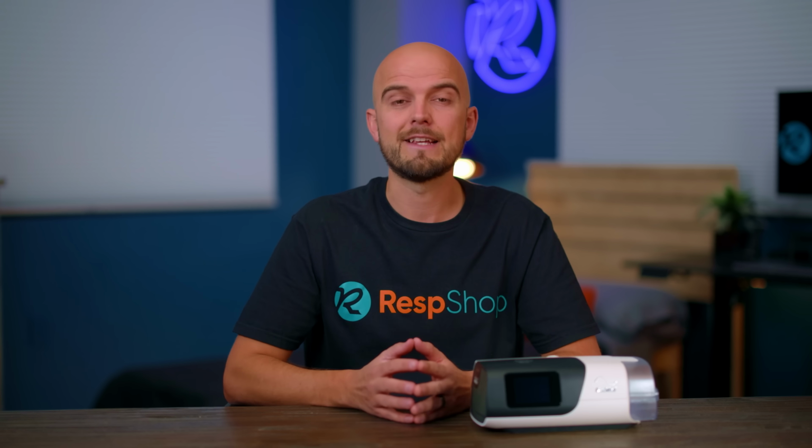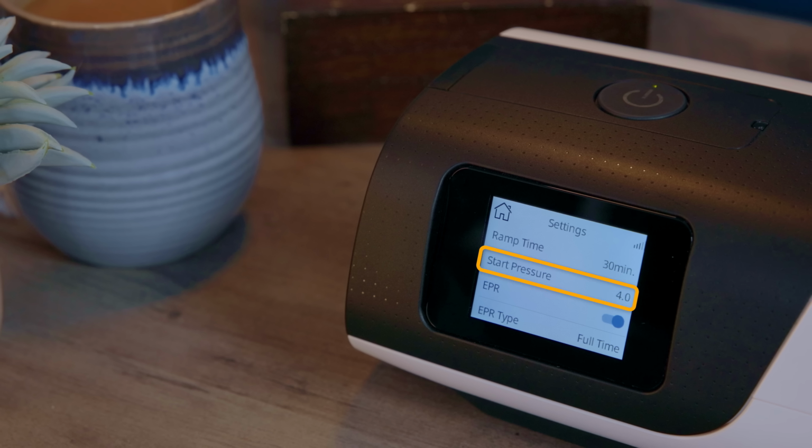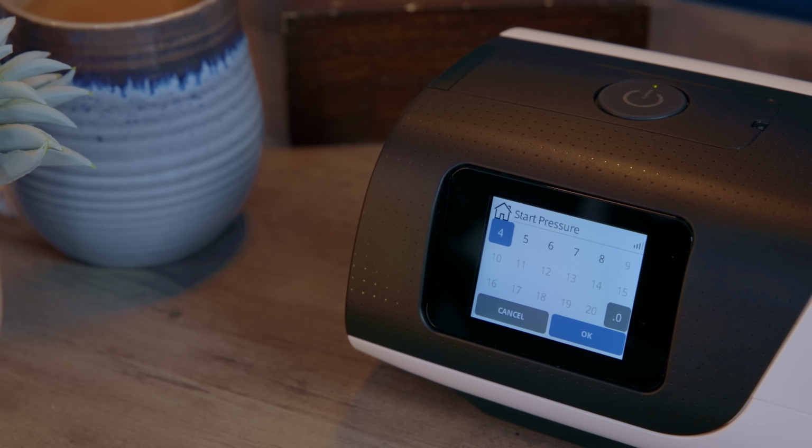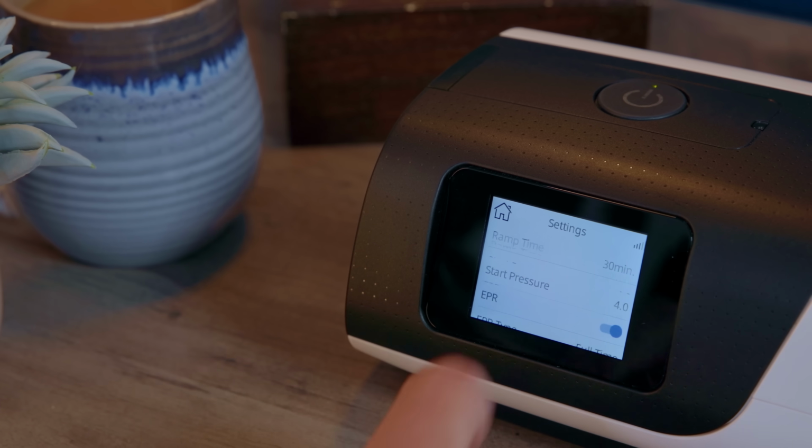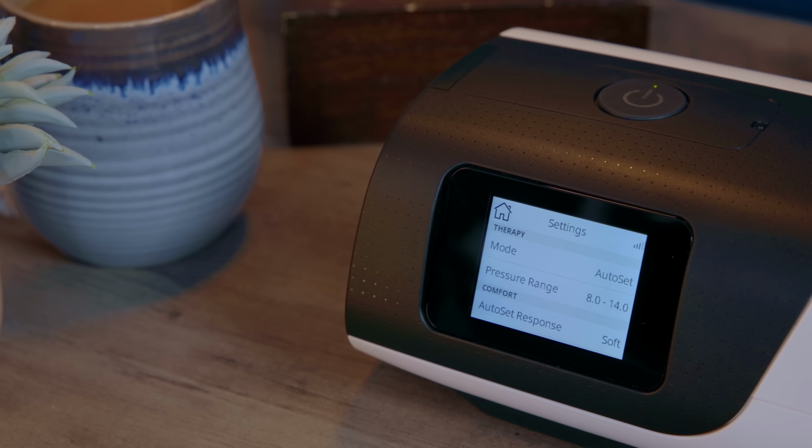The next setting is Start Pressure. This setting is linked to ramp and sets the pressure level that the machine delivers during the ramp period. The numbers indicate the pressure that it will be at the start of the ramp period. The lowest you can set is 4, and the highest will be whatever the lowest pressure in the algorithm can range between when your therapy pressure kicks in.